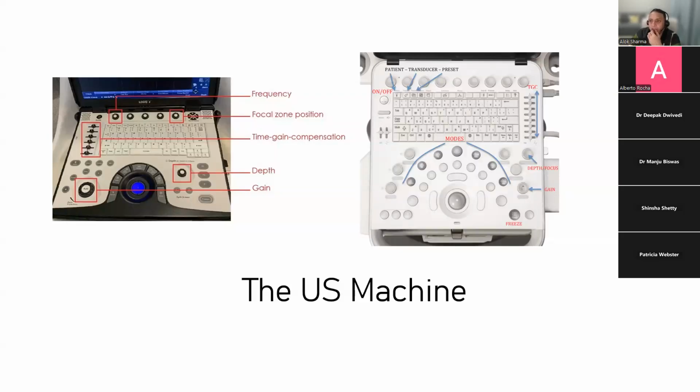Depending on what machines you have, if you want to make up presets, it's really important that you have a very good relationship with your engineers. And I would say that this is a really good opportunity during this course to get presets made for your machine based on what we're going to discuss in this and in peer review, so that you can make it much easier for you to start using the machine.